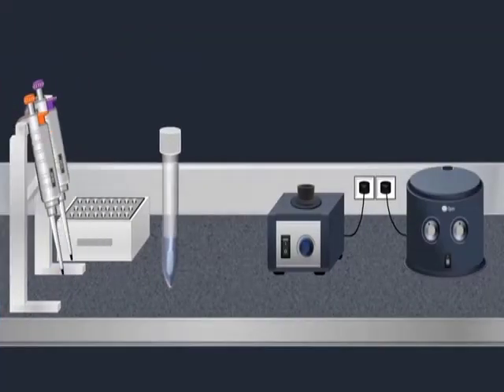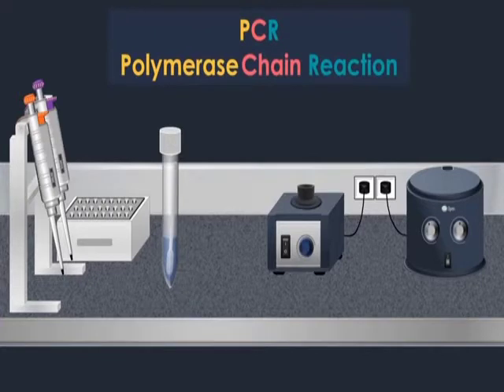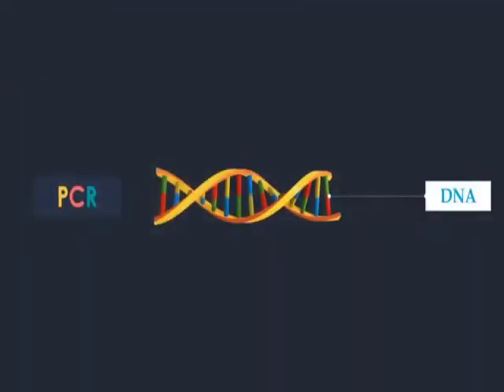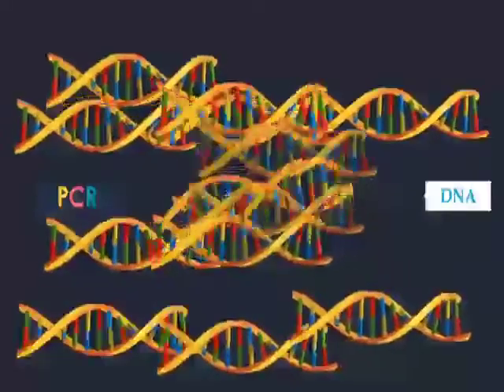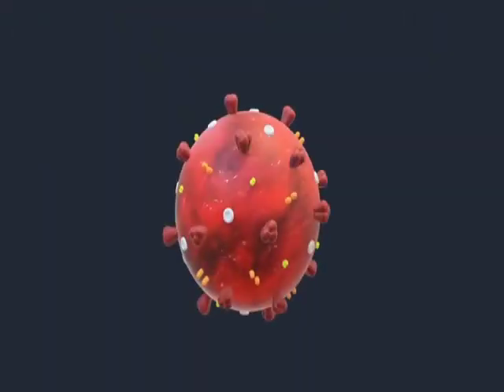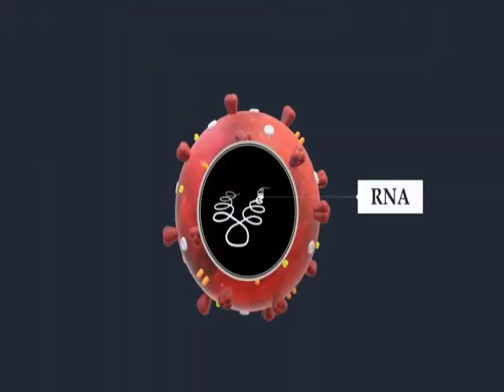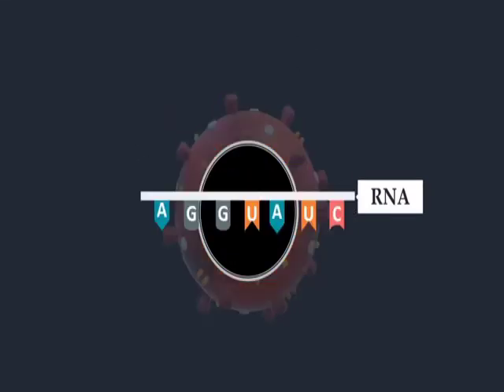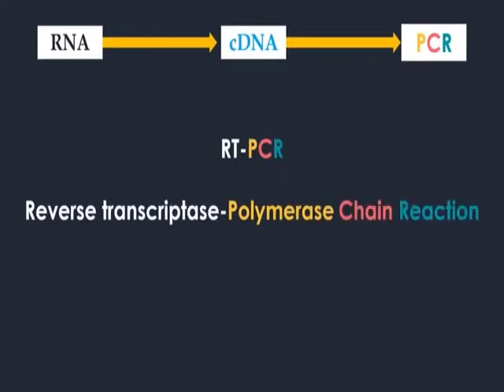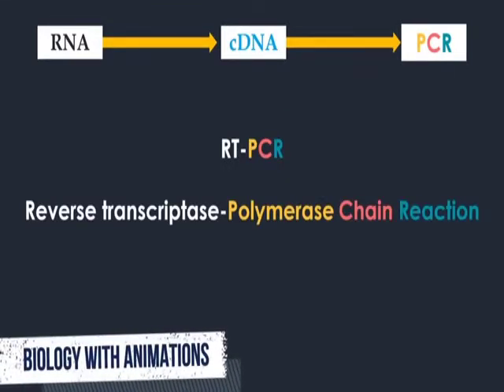The standard method of coronavirus testing is polymerase chain reaction (PCR), which is a method that is used widely in molecular biology to make millions to billions of copies of a specific DNA fragment rapidly. Coronaviruses contain an extraordinarily long single-stranded RNA genome. To detect these viruses with PCR, RNA molecules must be converted into their complementary DNA sequences by reverse transcriptase. Then the newly synthesized DNA can be amplified by standard PCR procedures. This approach is universally known as RT-PCR.